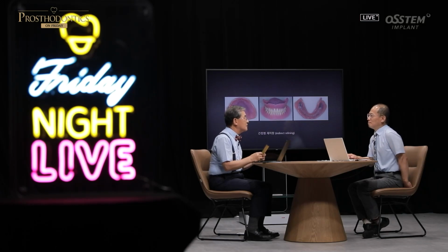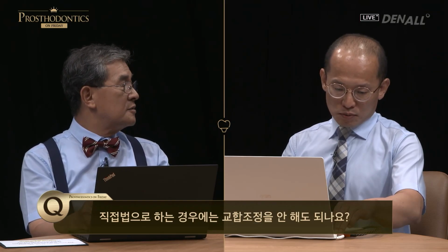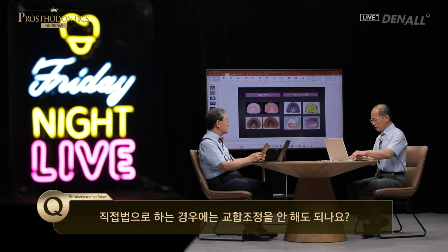Well, can I ask you some questions? Now, when you do relining, you seem to use the indirect approach. But for many dentists, when they use indirect relining, they get the denture again, do the various adjustments again. But for the direct approach, without occlusal adjustment, they sometimes do not do that. Would that be okay? Well, I don't know whether this would be helpful, but I just summarized in one slide.